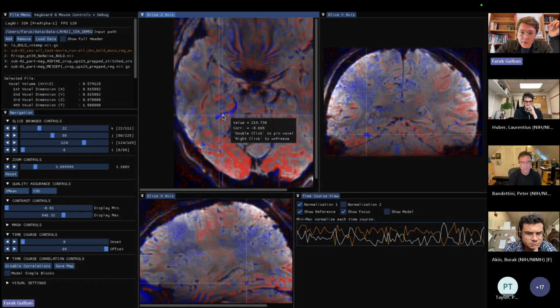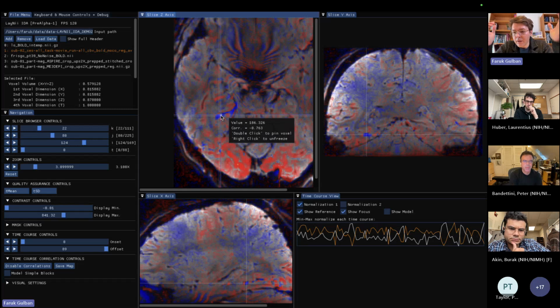That's why when the arteries dilate, they create an opposite effect in your fMRI signal. When there's activity, the arteries dilate and their signal is not inside them due to the blood motion artifact. Therefore, they just go down together with the activity.